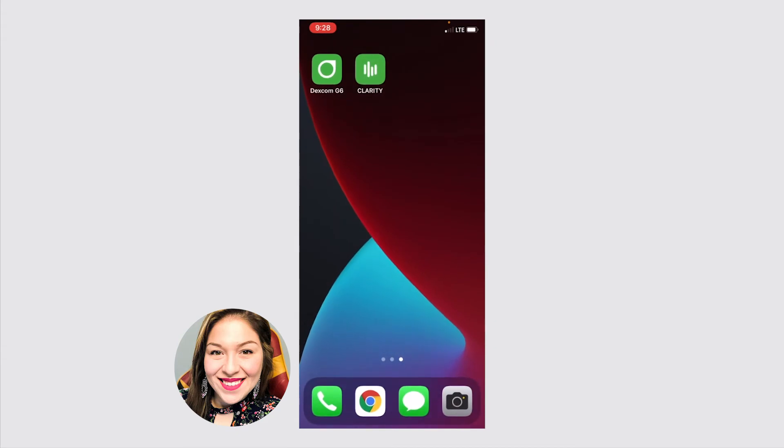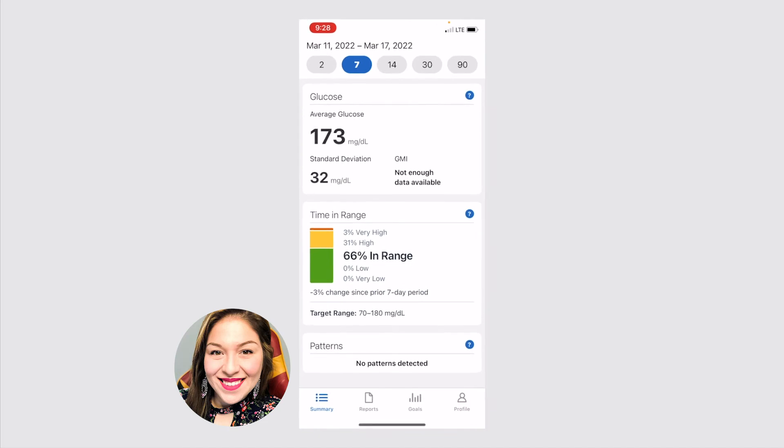Now, the other app, the Dexcom Clarity app, as I mentioned, is where all the information is stored after the 10 days are over. So as you change your sensor out every 10 days, the information is stored here in this app.